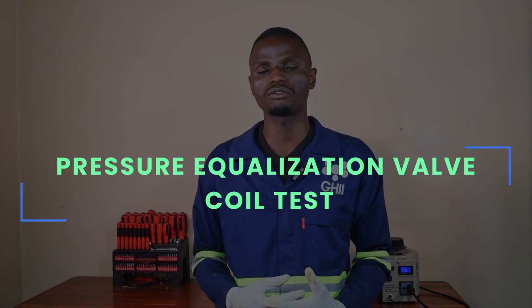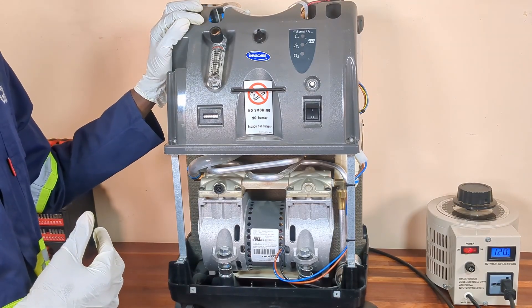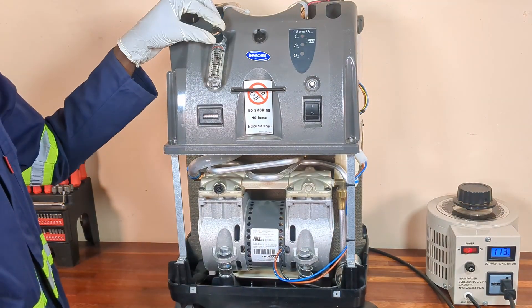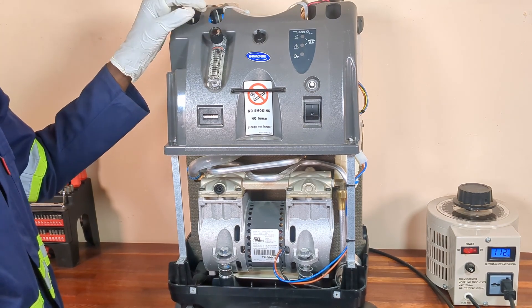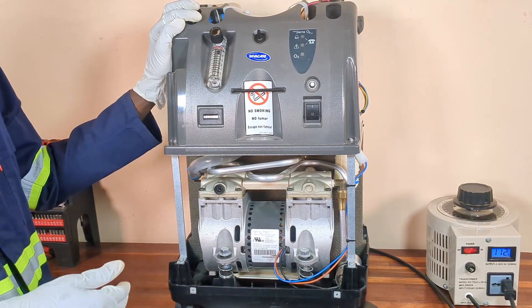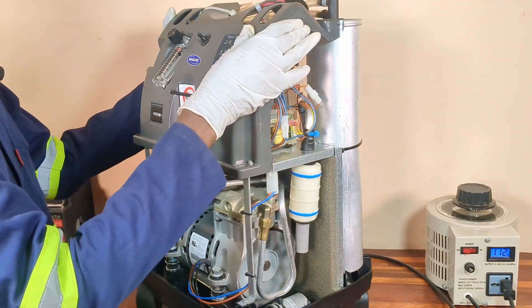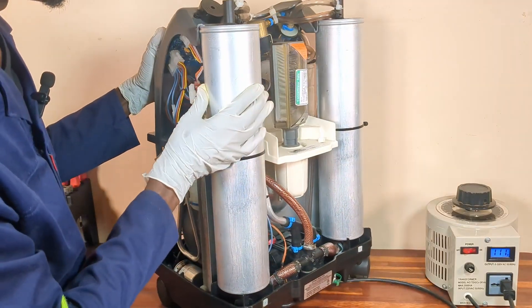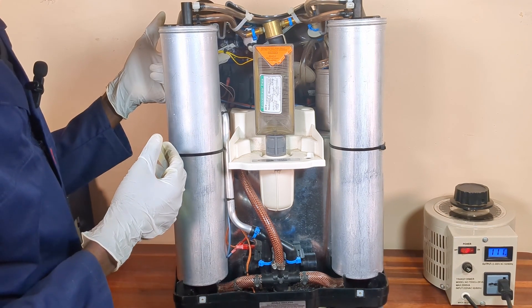Now let us look at how you can perform the pressure equalization valve failure test. This test is done to check if the system properly detects a failure in the pressure equalization valve coil or its associated circuitry. A malfunction of the valve prevents proper venting during the PSA cycle. To do this test, start by making sure that the oxygen concentrator is powered on and set to 5 liters per minute. After doing that, locate the two yellow cables going to the pressure equalization valve. You then need to disconnect one of these cables to simulate a pressure equalization valve failure.